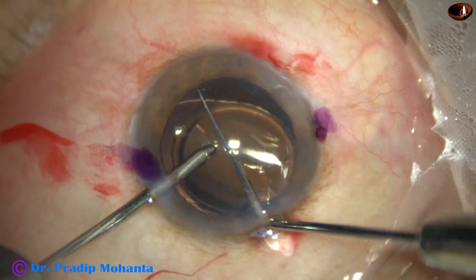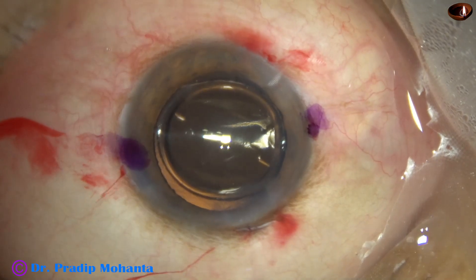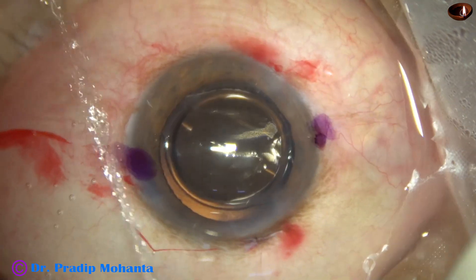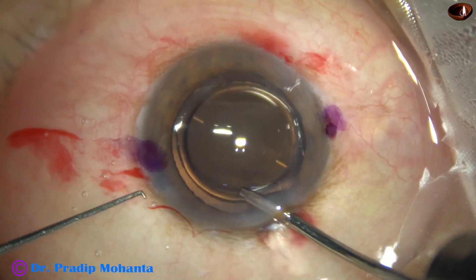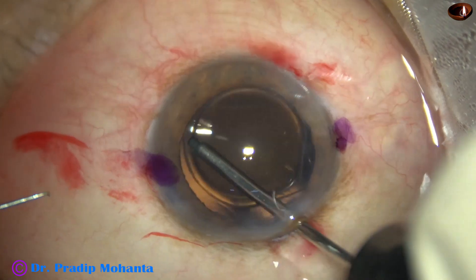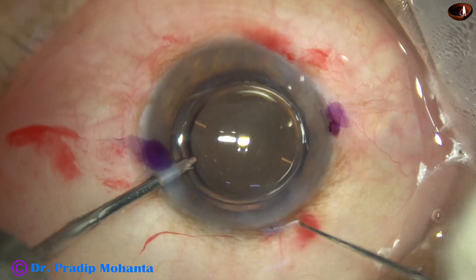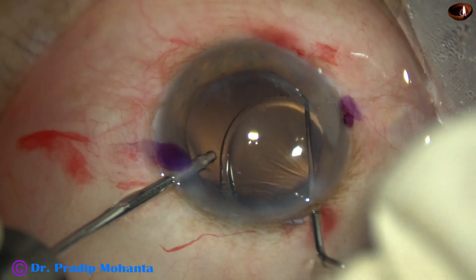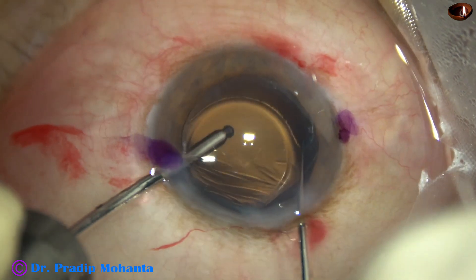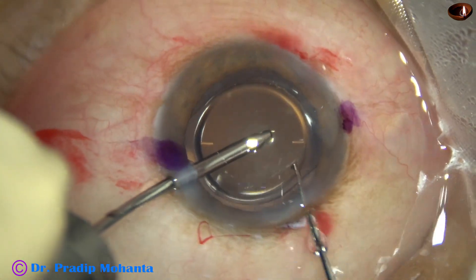I try to place the lens anti-clockwise, but the position does not happen. This lens has been made in such a way that it resists rotation in the anti-clockwise direction. So I keep the AC formed and use a Sinski hook to rotate and place the markings at 178 degrees.